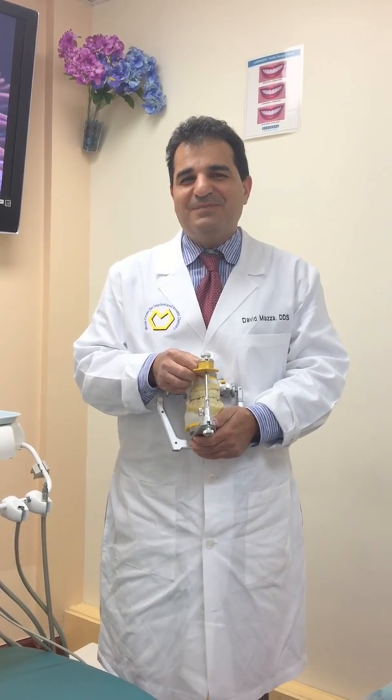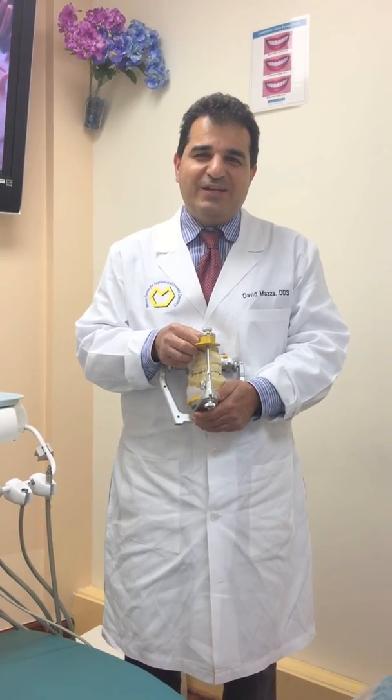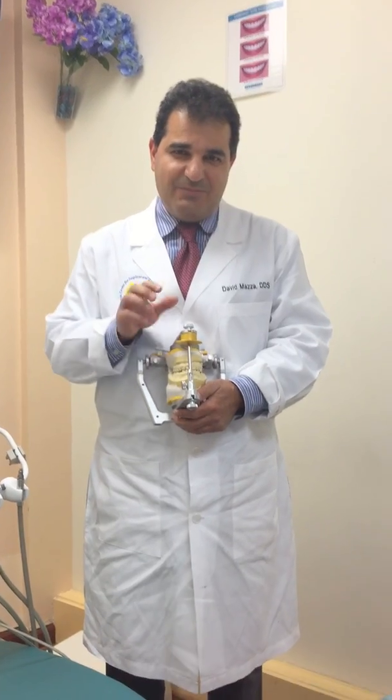Hello, this is Dr. David Mazza. Today I'd like to demonstrate how to establish anterior guidance on the SAM3 articulator.